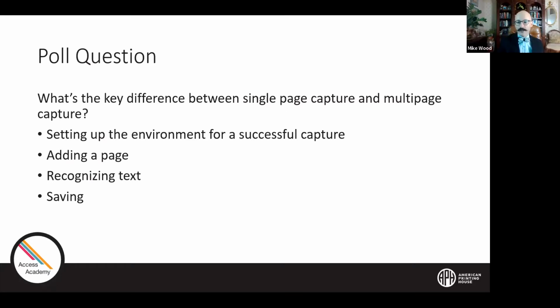So the answer is no. It will pick it up and show you visually, of course, because it would be the exact view, but it's not going to give you different audio. I know inside of JAWS, you can set it up to describe the text to you. This will not do that for you. So what you would have to do is view it in the exact view, maybe enlarge it enough that you can see it. And then you would see visually that it's italic or underlined, and it would just read the text. So no, it won't do what you're asking, unfortunately.